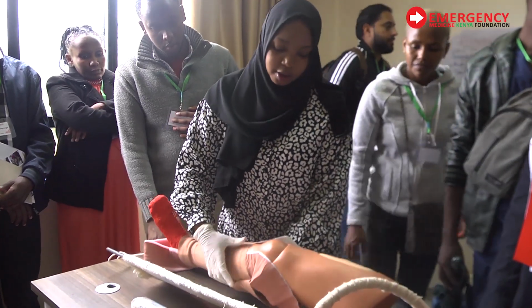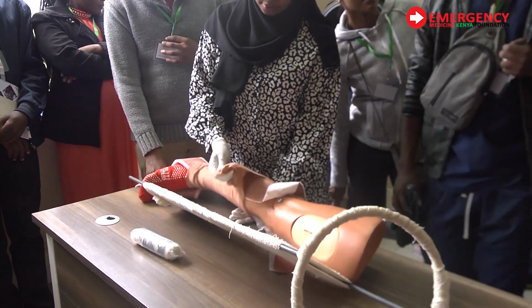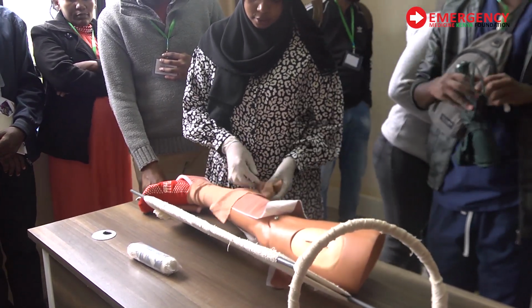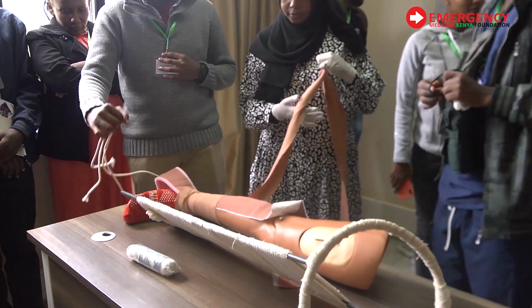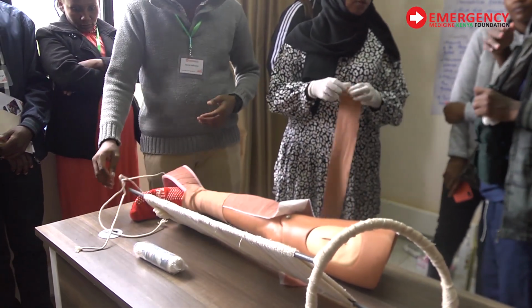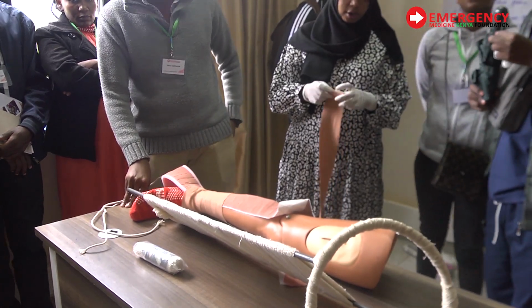It's just to secure. Let me roll it very well. To do the block, lateral to the femoral artery, yes.